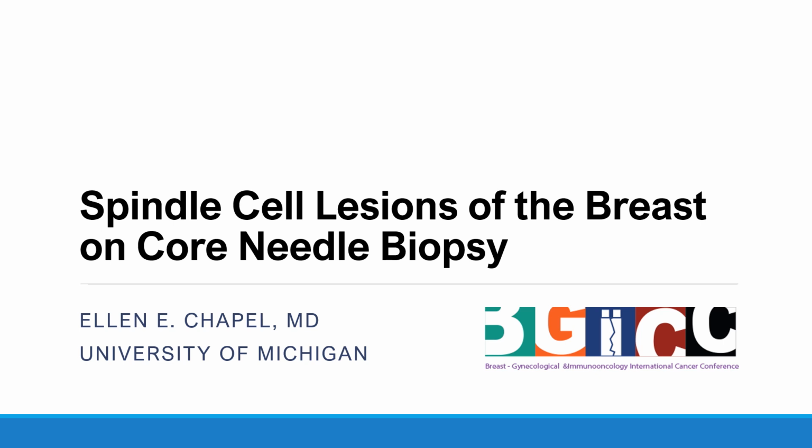I chose to speak about spindle cell lesions of the breast, as this is one of the most challenging diagnostic areas of breast pathology, particularly on core needle biopsy. Now, this topic is far too broad to comprehensively cover in a single lecture, let alone a brief session such as the one that we have tonight.